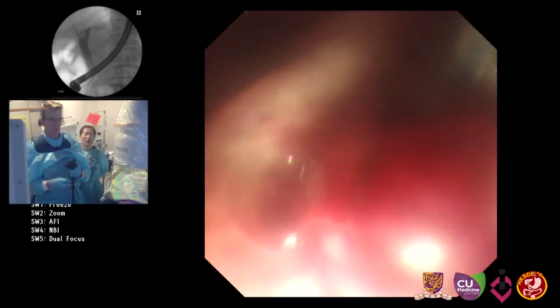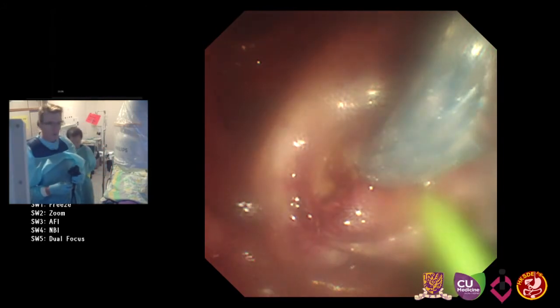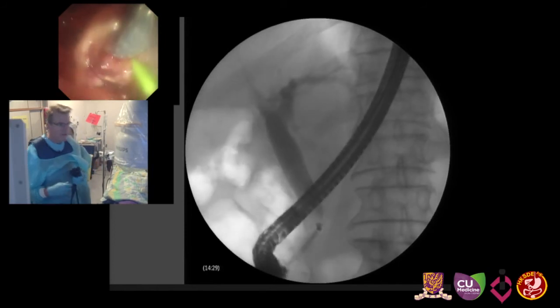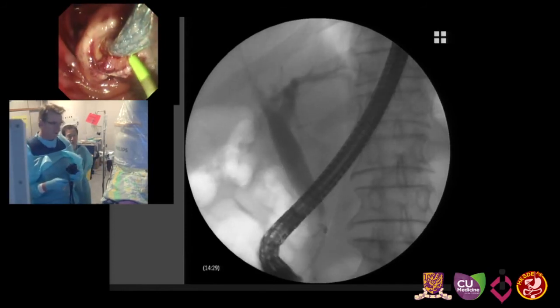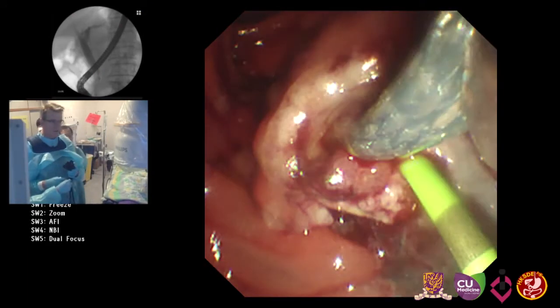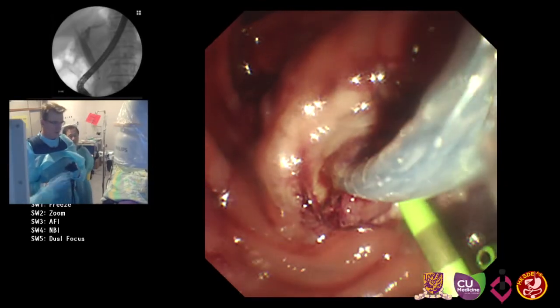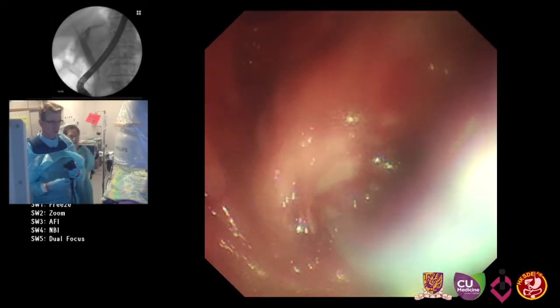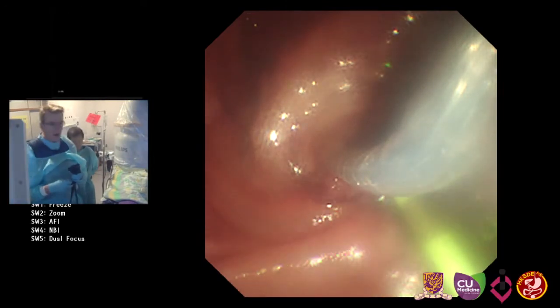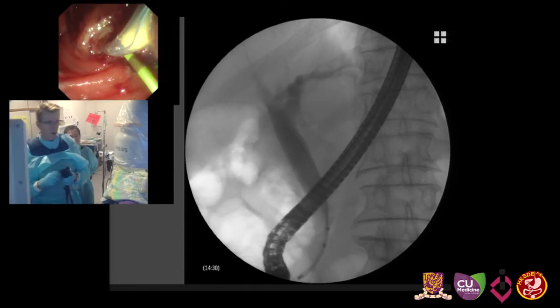Michael, do you want to do a full sphincterotomy or a partial sphincterotomy before? I think you've got to be careful to avoid doing a full sphincterotomy in these ampullectomy patients, because you run the risk, a genuine risk, of a little retroperitoneal perforation. Oh, so there's no need to do a sphincterotomy, in fact. So we just do a little one just so we can seat the stent more pleasantly, and then we have the opportunity to have a wide open papilla when we come back.